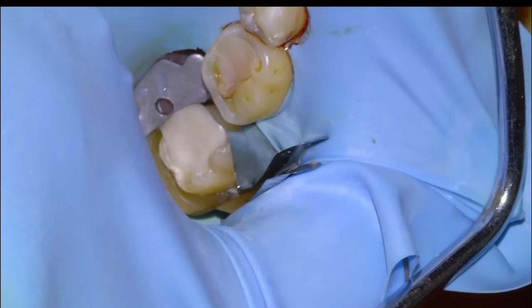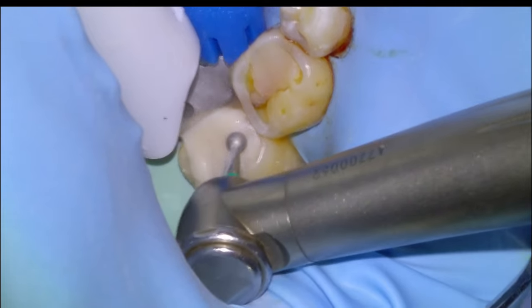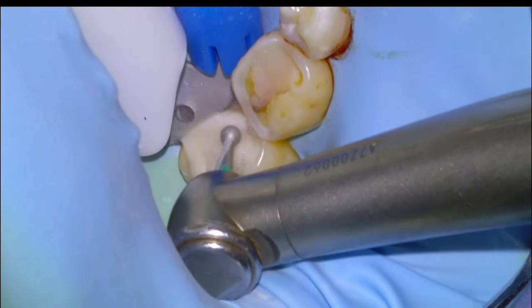So we'll overfill the cavity and then pack it in with a moist cotton pellet, wait five minutes for the material to set, and then come back, remove the matrix, and start removing the excess restorative material with a large round diamond.